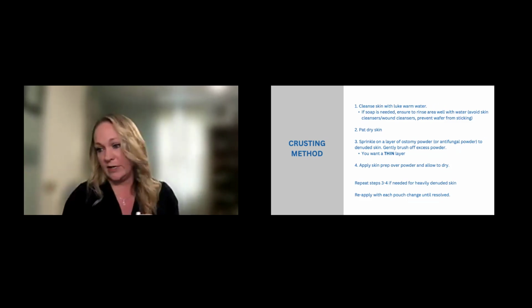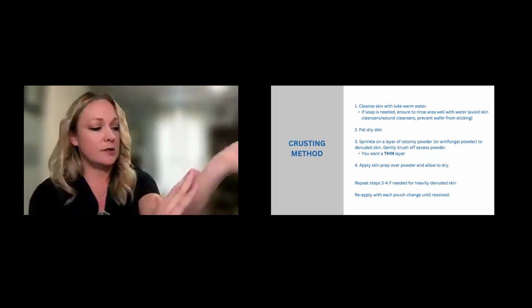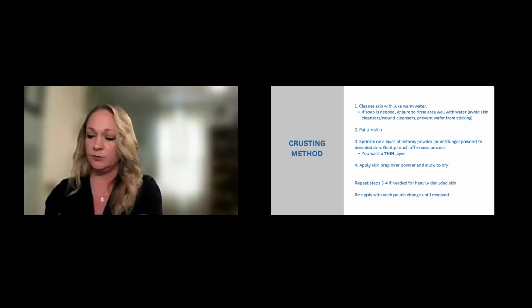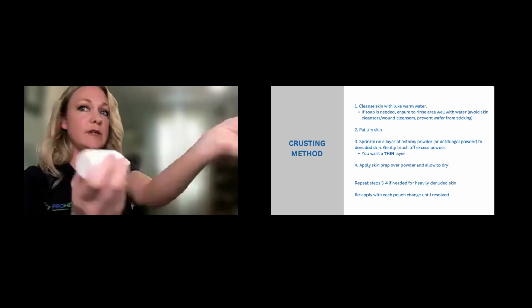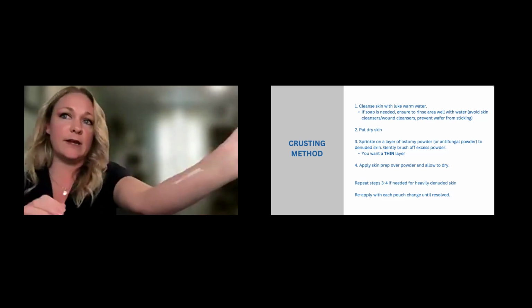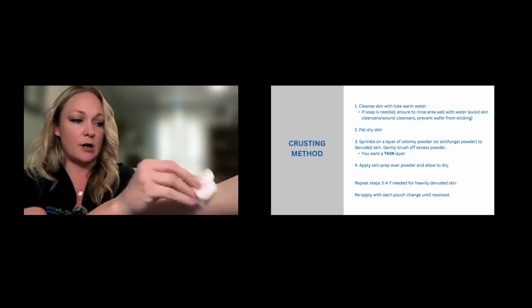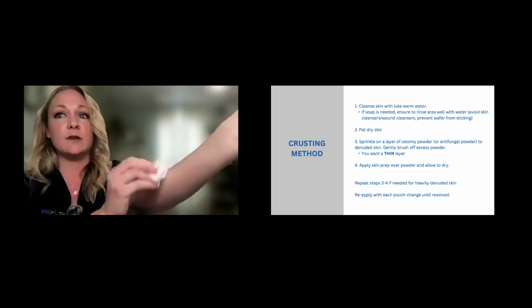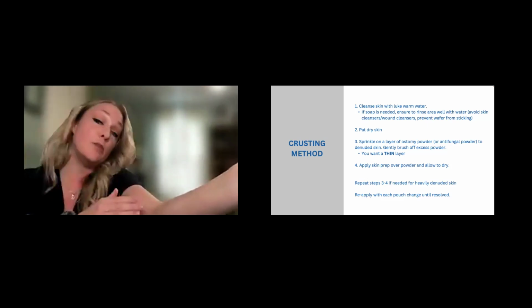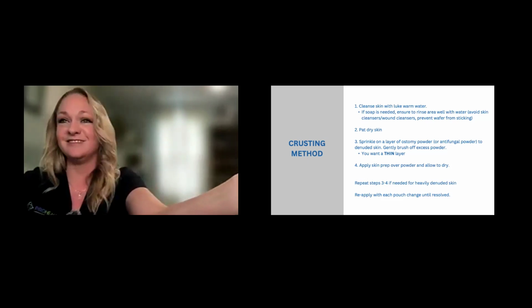I don't know if you guys will be able to see me well, but let me try to practice here. So say my skin is wet. Don't know how well you'll see, but I'll do a nice thin layer of the powder. And then we want to make sure to brush off the excess so it's only sticking to the open areas, okay? We'll do that. Please don't blow on it. I've seen some people come up and blow on it. Don't blow on your patient's stoma.